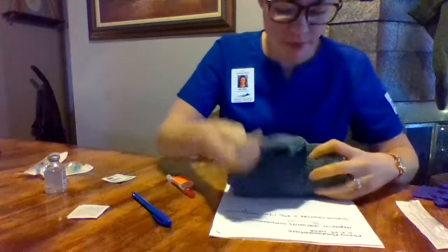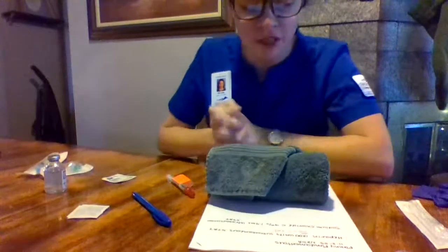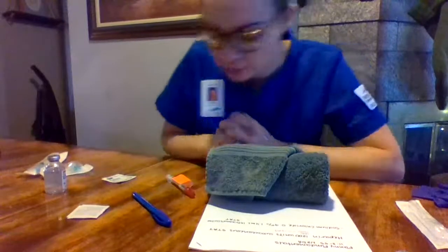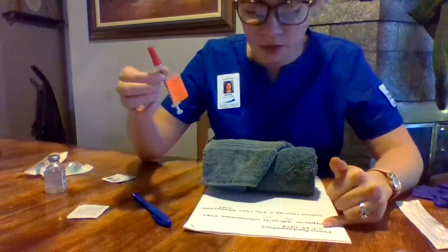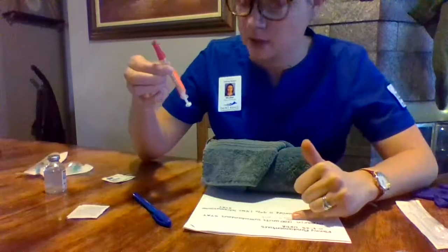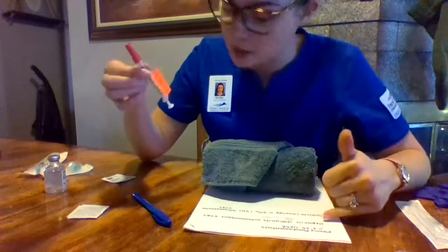Hi, my name's Lainey. I'm going to be your nurse today. Can you please verify your name and your date of birth for me? Okay, Fanny Fundamentals, 11/3/55. Do you have any drug allergies, Fanny? No? Okay, and what about latex? No. Okay, wonderful. All right, I'm going to do my last 6 rights. So we have Fanny Fundamentals, 11/3/55, receiving heparin, 1,200 units, 0.12 milliliters, subcutaneously, stat. This medication is not expired, and I will document this all later.